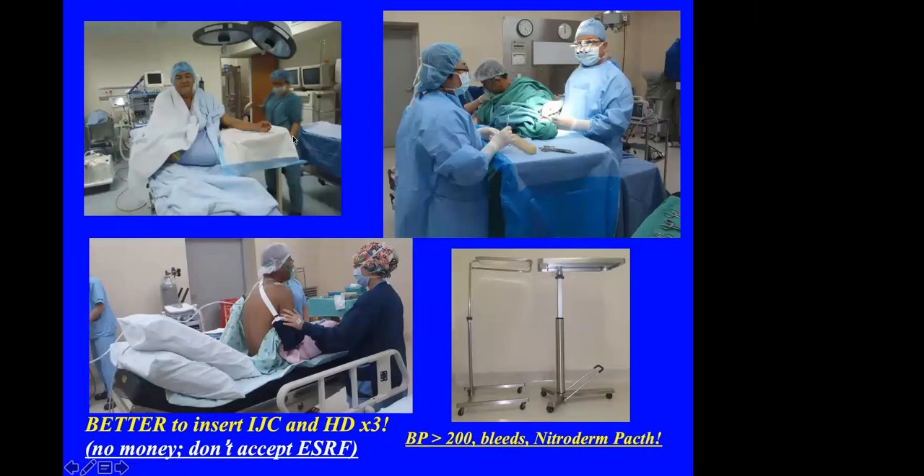Some patients are obviously fluid overloaded and do not want to be — or have no means of being — dialyzed with a catheter first. There was one such patient who insisted on doing the AVF although he said he could not lie down. So we had to adjust the operating table. Sometimes we have to do the operation with the patient sitting up, or provide some oxygen if the patient cannot breathe halfway through the operation after the vessels are already opened.